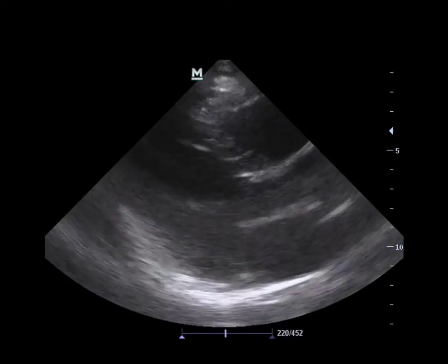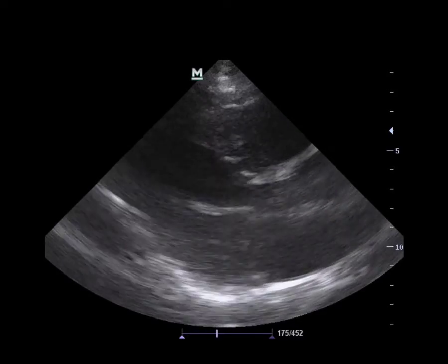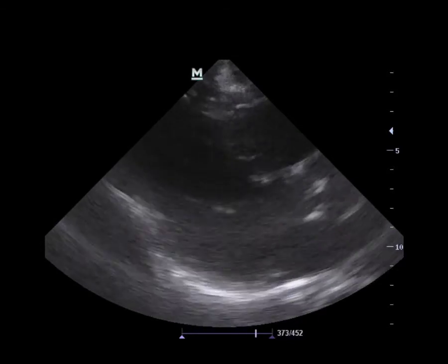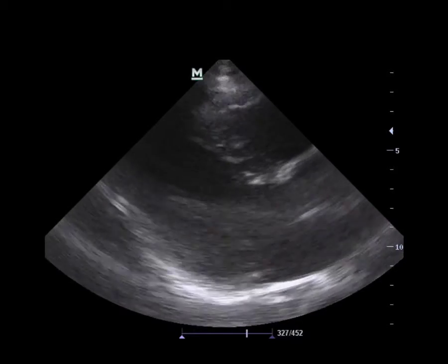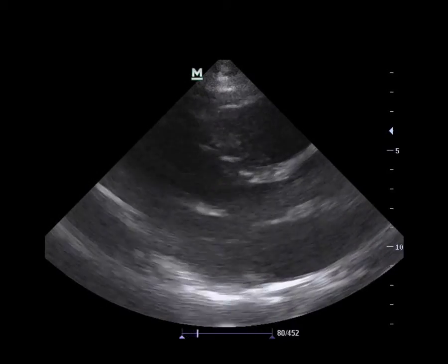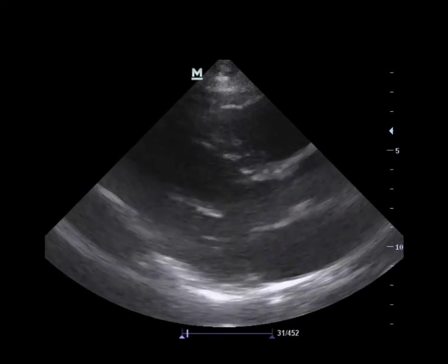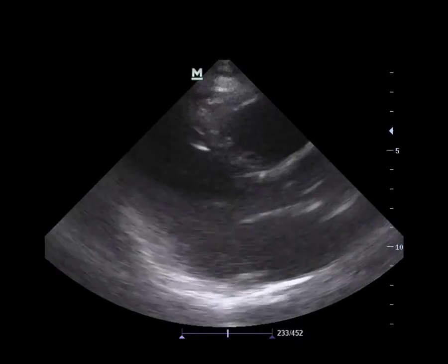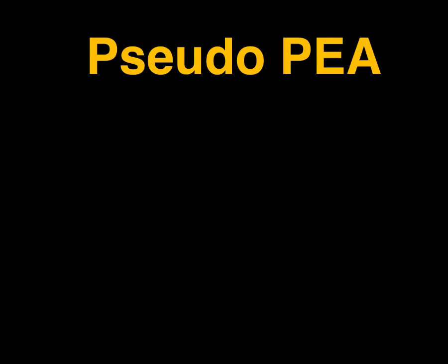I'm sure you might be thinking at this point, well, I'm showing you zebras, right? This is uncommon. But this is just another case. Another patient that was brought in also with no palpable pulse. We put the probe on, and this is what we saw in bedside ultrasound. Severe shock, EF roughly 10%. Again, this patient needed pressors and a search for a cause, not the 1 milligram of epinephrine that we're usually giving in cardiac arrest. So this leads to the term that I should introduce formally here, which is pseudo-PEA.